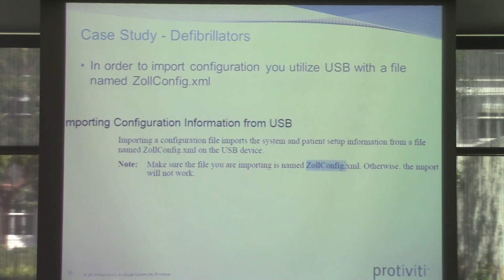All right, so once you get to the device, here's exactly what we need to do, and this is done from the documentation. So, XML.